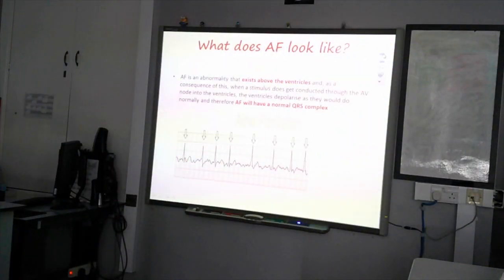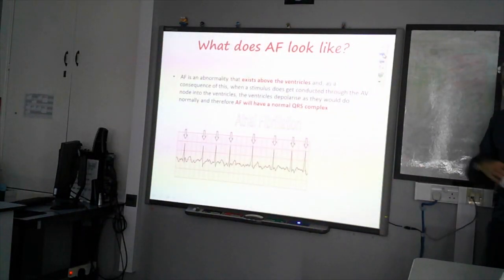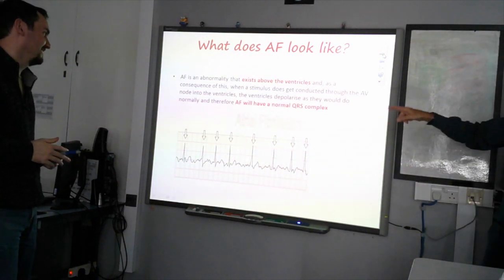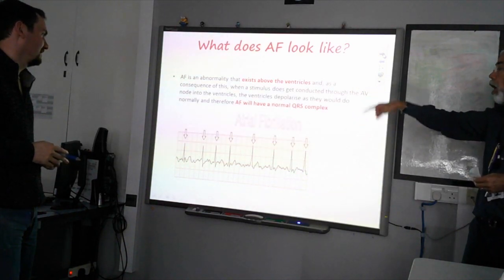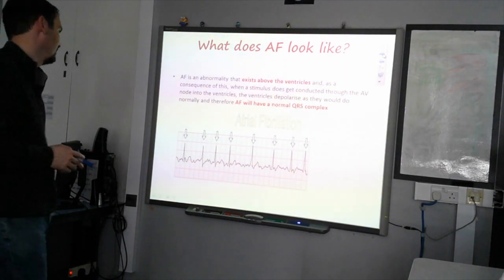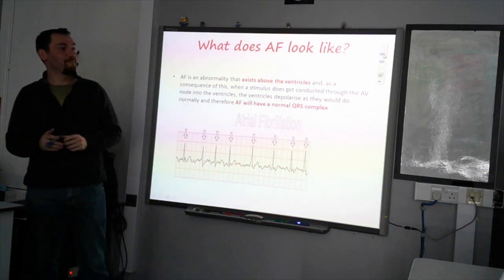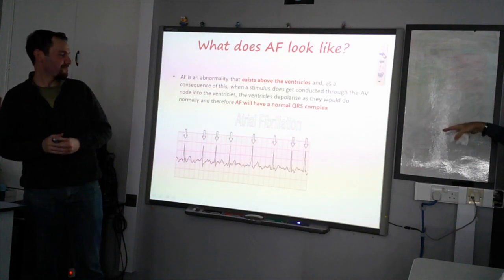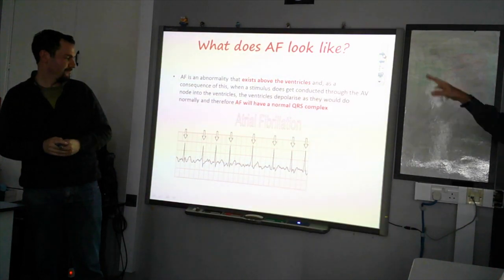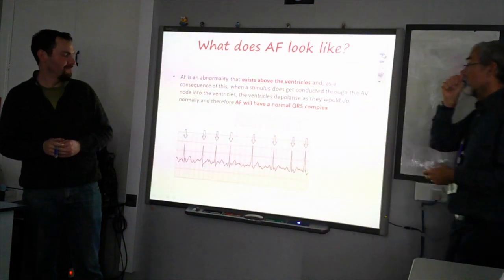What's your first name? Philip. Okay, Philip. Are you alright? That's fine. Phil, if you look at the arrows pointing down, are all the spaces between the arrows uniform? No. So can you see that Q, R and S is still happening, but can you see now it's very irregular? Can you see it's no longer nicely regular all the time? These gaps are different. Okay, well done, Phil.